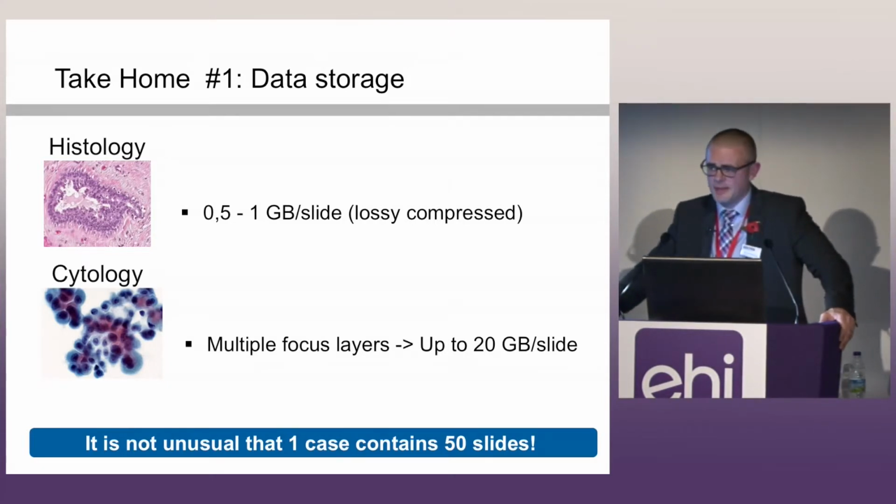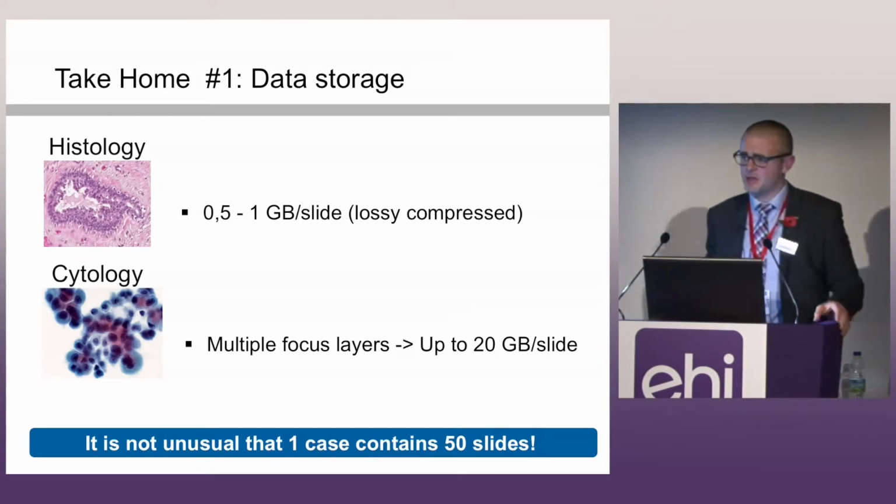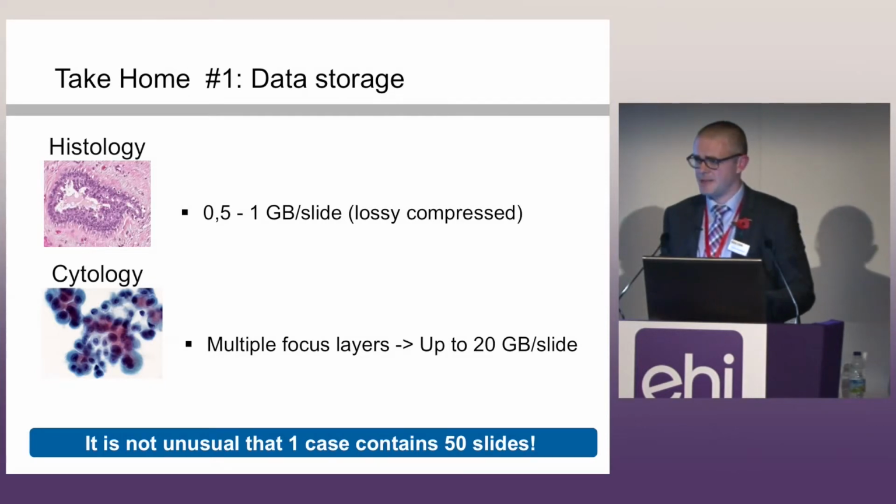However, what I would say is that radiology departments have been producing this level of data for some years now. We typically engage with trusts producing 500,000, 600,000, 700,000 radiology examinations per year. Conversely, the numbers in pathology are much, much smaller. So in terms of data quantities, we're quite used to handling this level of data. And again, I urge you all to consider what has been done in radiology and leverage that back-end infrastructure.